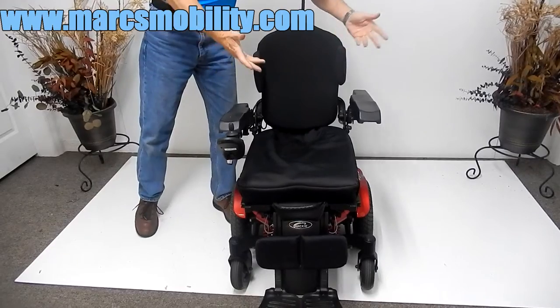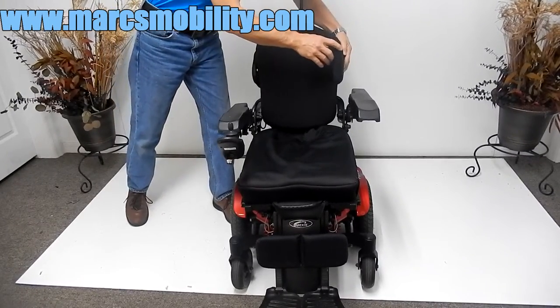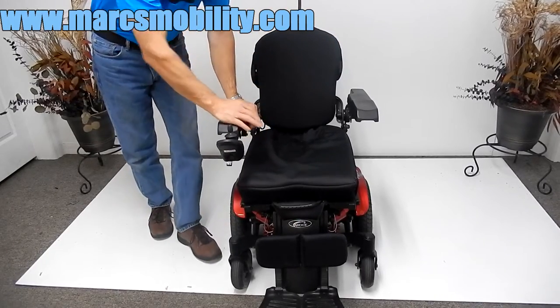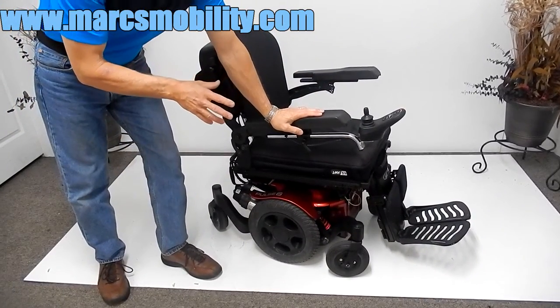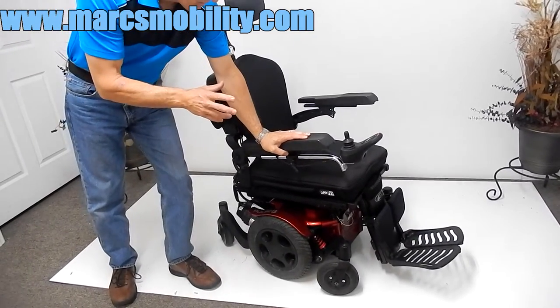You have lateral support which can be taken off if you want. This is not a large chair, so it would be for a person of medium to small size. This chair is fairly quick — it does take two batteries, and this chair works on two 55-amp batteries.